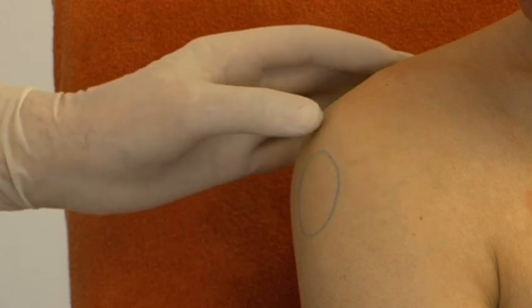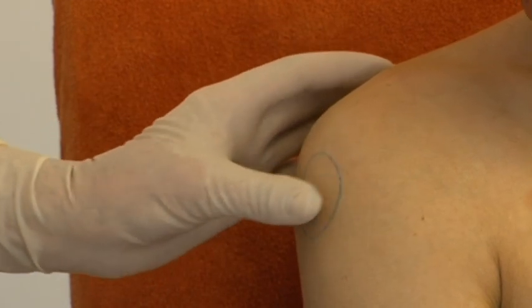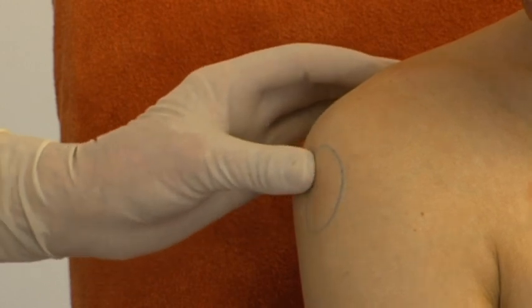The painful extent of the bursa, accessible to palpation, is accurately identified.